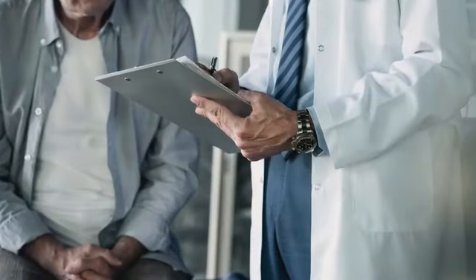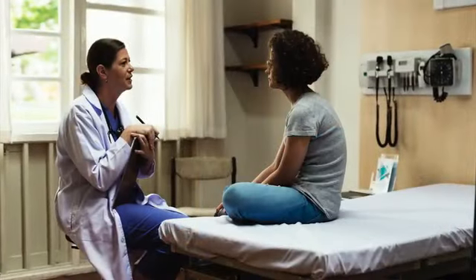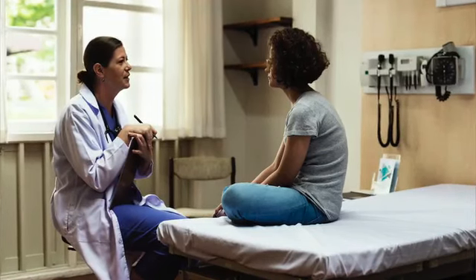Your healthcare team will provide you with instructions on what to do to prepare for the procedure. So this may include instructions on medications as well as eating and drinking restrictions. It can be helpful to wear loose and comfortable clothing on the day of a medical procedure and also leaving valuables such as jewelry at home.